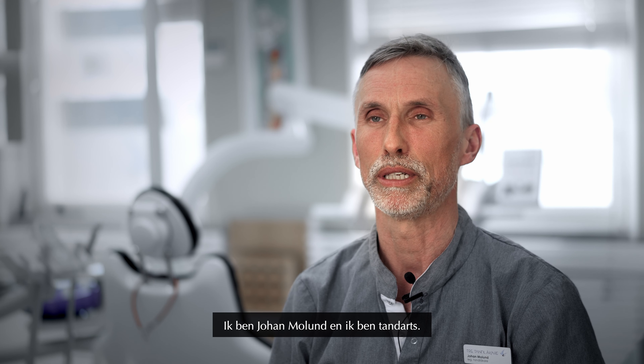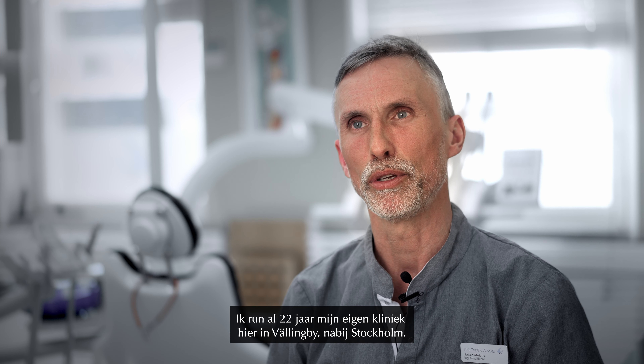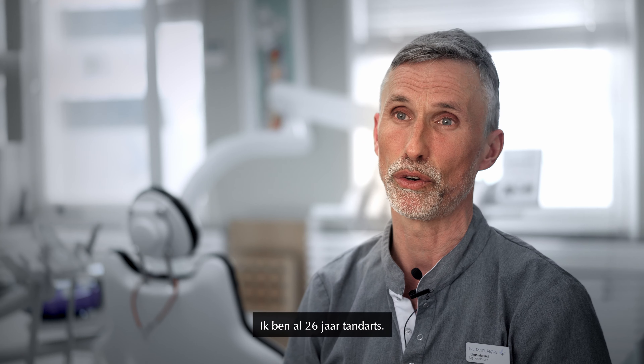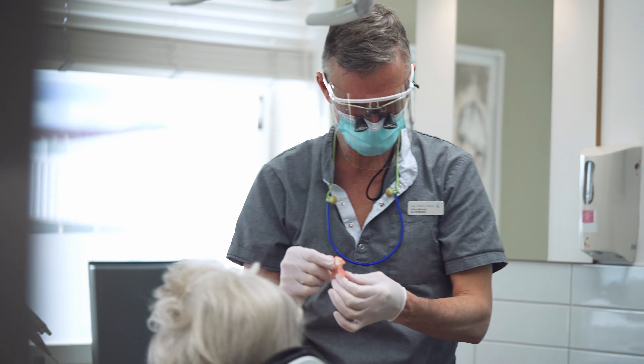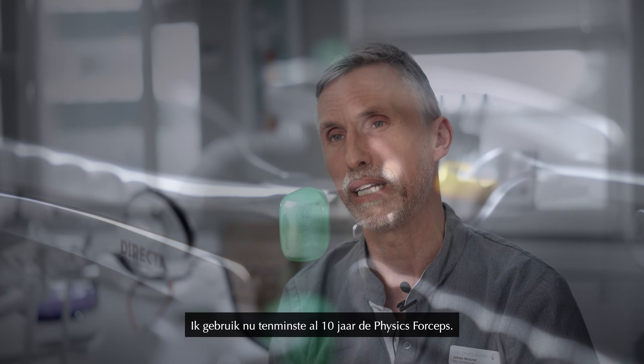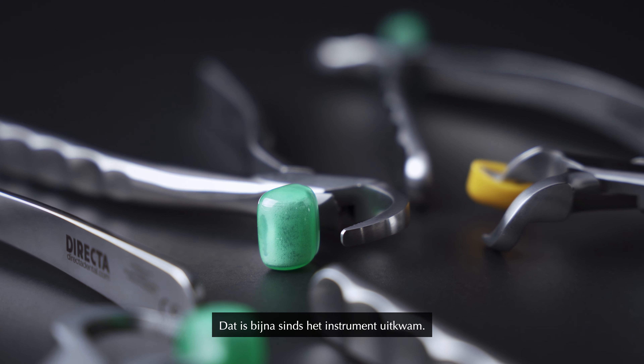My name is Johan Molund. I'm a dentist. I'm running my own clinic here in Vällingby, Stockholm for the last 22 years. I've been a dentist for 26 years. I've been using the Physic forceps for at least 10 years, almost since they started coming out.